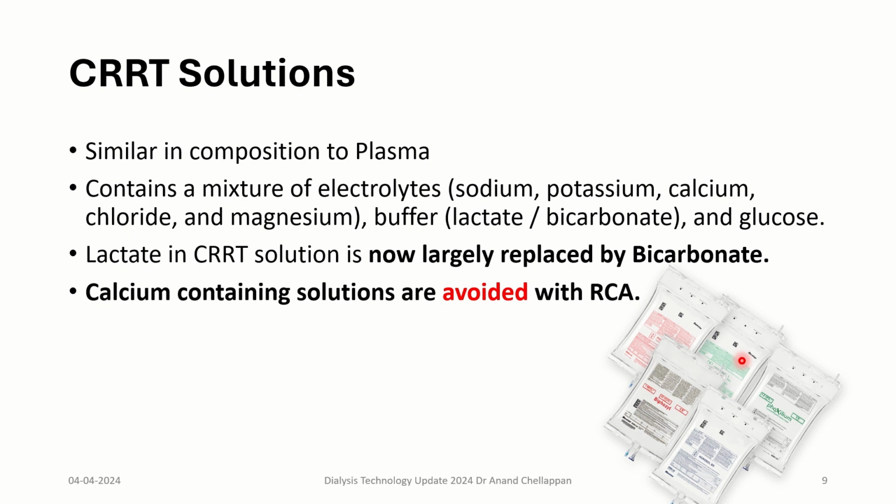So the image shows some of the available CRRT solutions. There are multiple brands of CRRT solutions. The listeners are advised to review the composition of the CRRT solutions, and more regarding these solutions would be discussed in the upcoming workshop. Some of the solutions contain phosphate, and as we had previously discussed, the buffers differ between the solutions, and which solution to be used in which condition would also be discussed in the workshop.